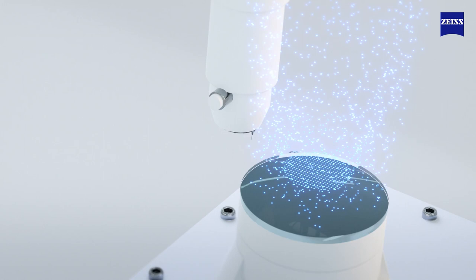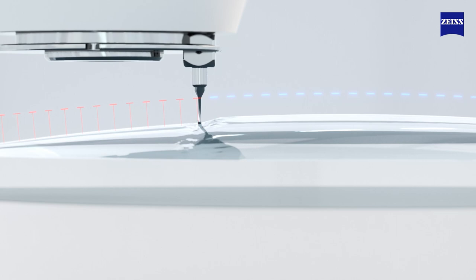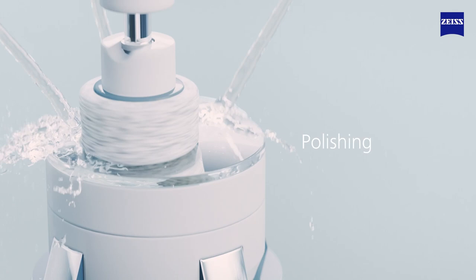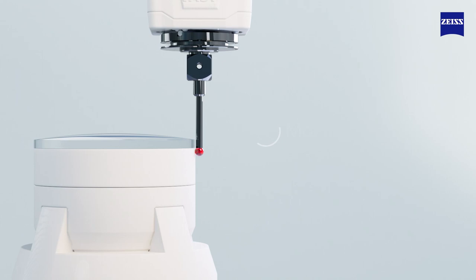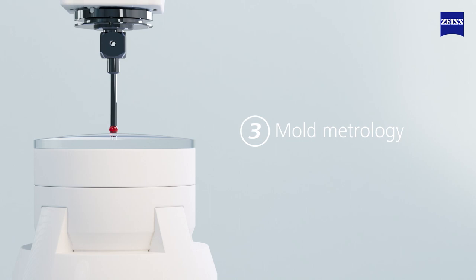The lens production starts with the making of free-form glass molds, which are used in the casting process. State-of-the-art computer numerically controlled glass mold generators transfer the complex Clearview lens surface designs to the glass molds, which are then polished to a very high optical grade. In the third step, Zeiss coordinate measuring machines check over 1,500 points on each surface of every mold to ensure accuracy and precision against the free-form design. The mold is now complete.